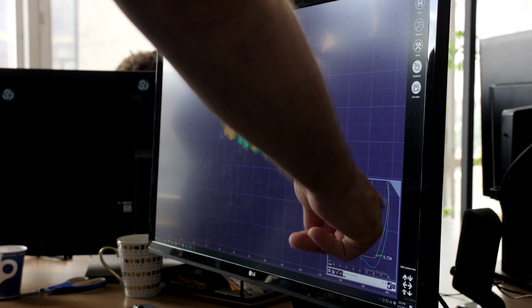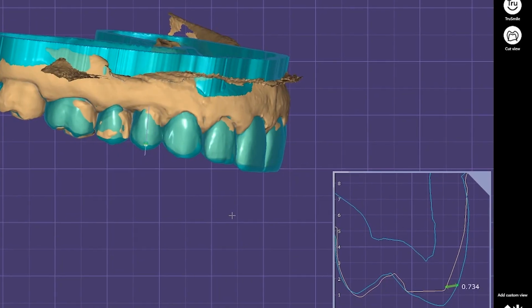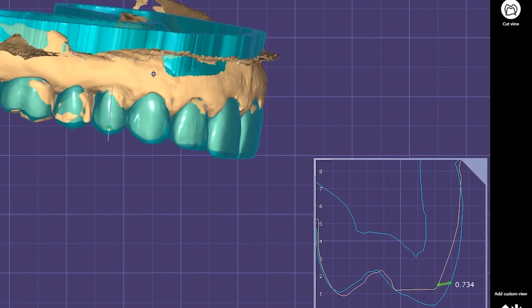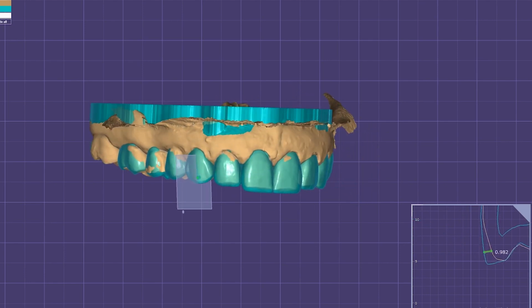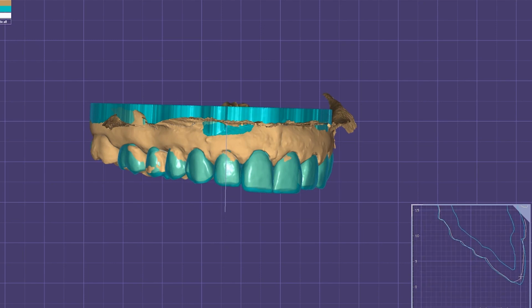See, this area you still need to remove. Here is more than enough space. It's nice to have a gradient like this, but it has to be a space that is millable. So just in the cervical, a little bit. Measure in the middle, please, because there it's clearly enough.